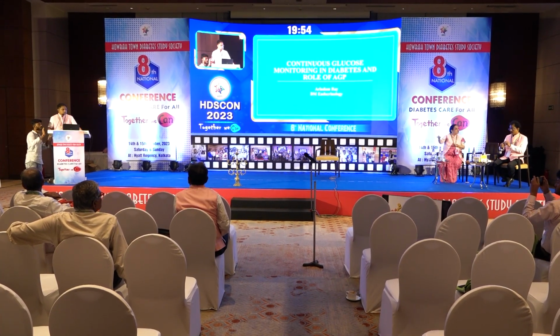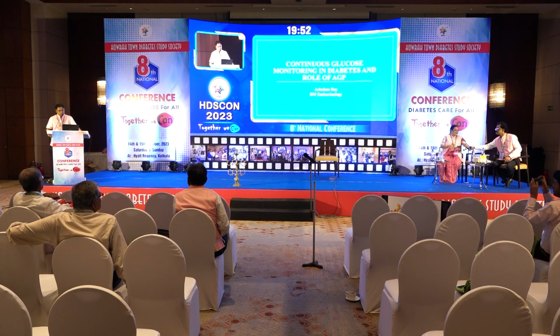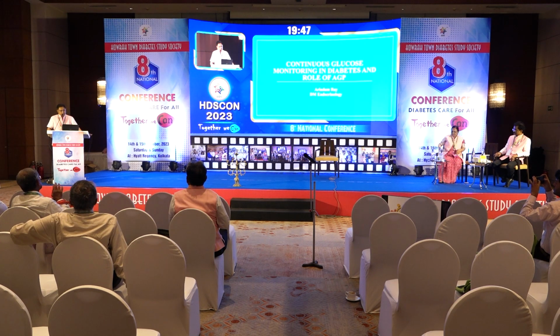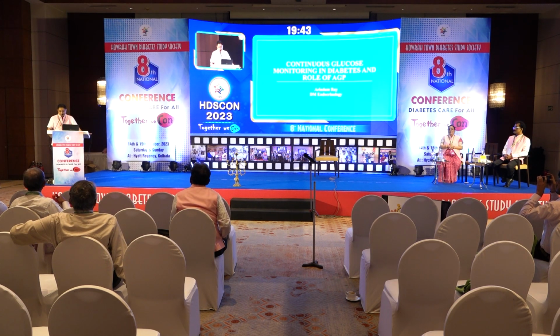Okay. So how to apply this device on patients' arm, and how to actually, sir is a bit panic about whether it's painful or not. But this is a true message that we have to deliver to the patient, that it's absolutely painless. And there are some issues with the adherence of the device over the skin because of increased sweating, because of our climate. So that makes some sense for some kind of patient. But truly speaking, it's a very important tool of diabetes management nowadays.